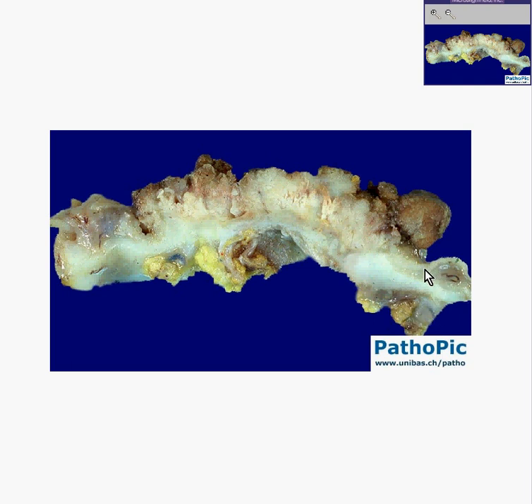Notice how this mucosa all of a sudden becomes no longer uniform, and it is thick, and it gives rise to this mass which is irregular, and perhaps it may even infiltrate, as you can see here, into the muscular wall as well. Notice that this whole thing here can very easily be described as tumor.